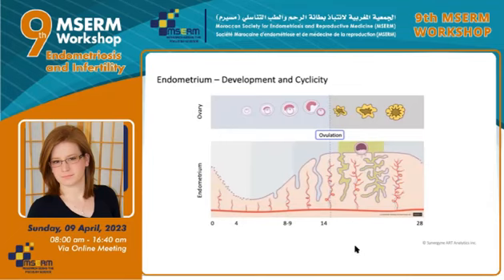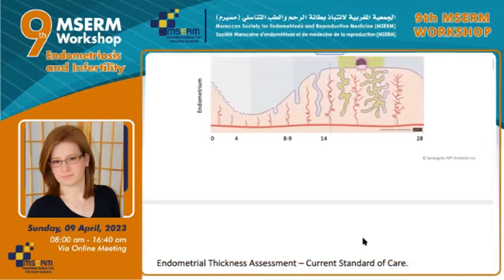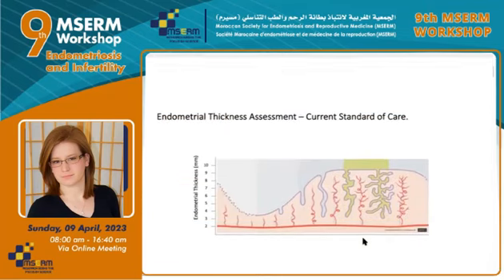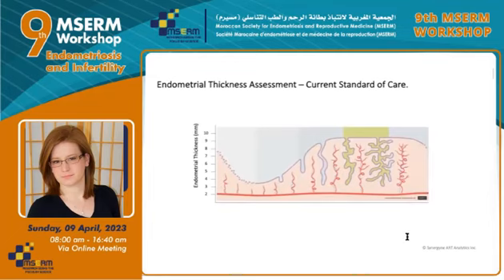So we have tools and technology available to assess the uterine cycle and the endometrial health, like hysteroscopy, biopsy, and the downstream histological or lab-based gene detection methods and multiple types of imaging. Of the tools and technology that we have available to examine endometrium, ultrasound has become fundamental and widely used, which makes a lot of sense. It's relatively non-invasive and can provide information rapidly.